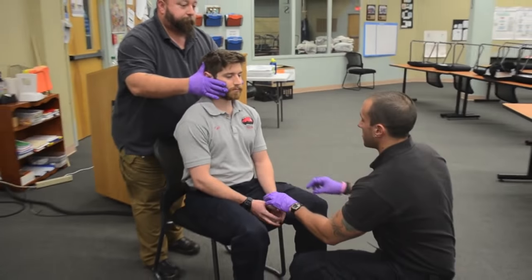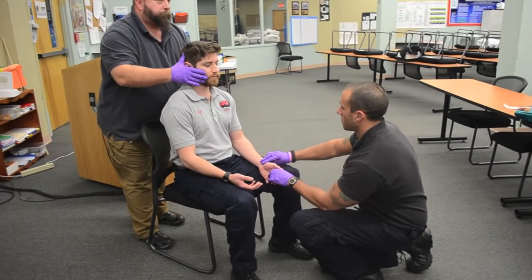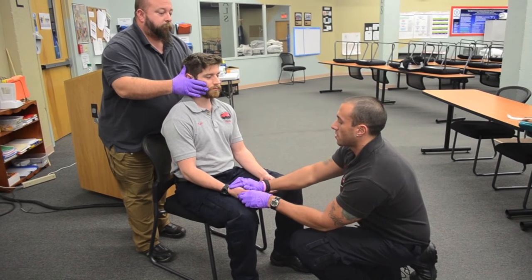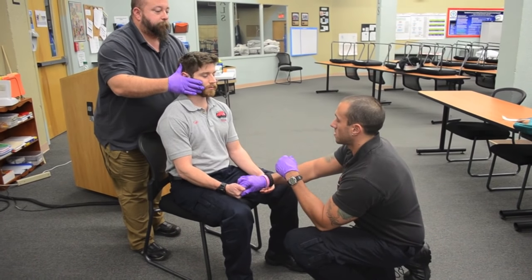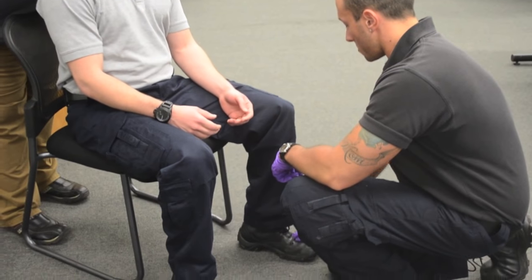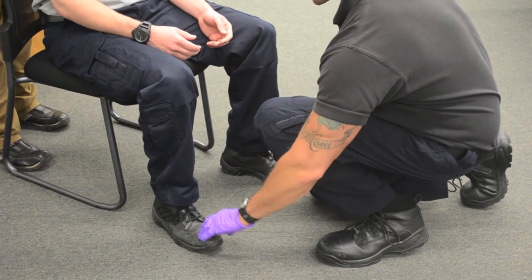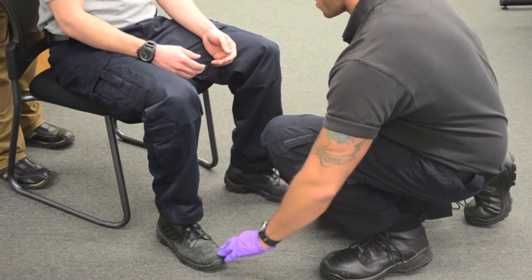At this time I am going to check for PMS in each extremity. I am going to feel for a radial pulse — pulse is present. Sir, can you feel this? Can you squeeze my fingers? PMS intact. Check for radial pulse — pulse is present. Sir, can you feel this? Yes. Distal pulse present. Sir, can you feel this? Yes. Can you push up with my fingers? PMS present in all extremities.